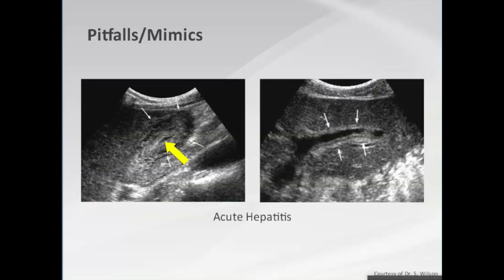Pitfalls and mimics are very important. A case given by Dr. Wilson: a patient presenting 'rule out acute cholecystitis' shows the gallbladder lumen almost completely obliterated with one of the thickest gallbladder walls you're likely to see — this onion-peel edema. The liver shows increased echogenicity in the periportal triads. Know your patient: speak to them, look at the chart. The transaminases are very elevated — this is acute hepatitis with secondary thickening of the gallbladder wall.